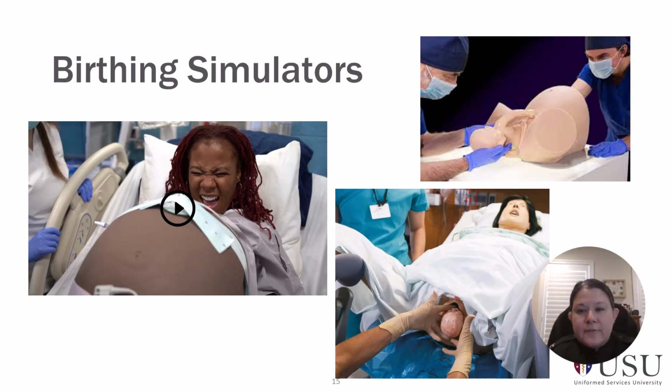And then there are a variety of different birthing simulators that can simulate a birthing scenario. You can see up in the upper right-hand corner is an example of a task trainer. This is great for practicing specific procedures. And then there are some more realistic, kind of down in the middle, simulators that would be considered high fidelity with mannequins that can talk and breathe and seize and move.